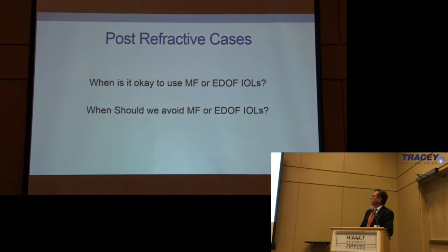So now we get to our post-refractive patients. For many years, I was really scared about using multifocals and extended depth of focus lenses in my patients that were post-LASIK, because I didn't really have the tools to understand. Just from having topography, you really can't tell the whole story. And we would have patients, when we tried putting multifocals in our post-LASIK patients, and definitely not in the post-RK patients, I'll show you why.